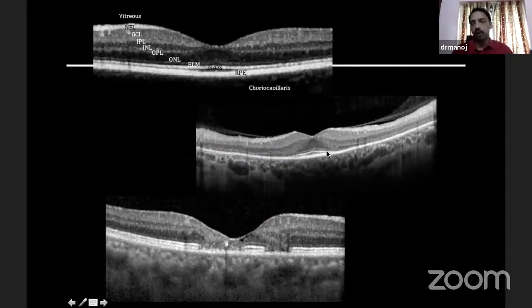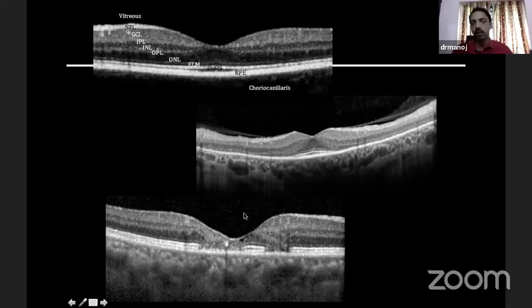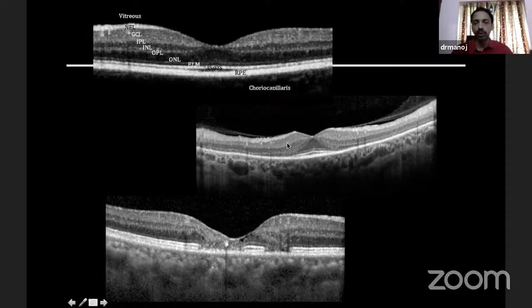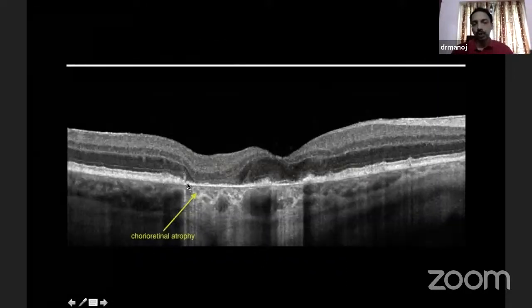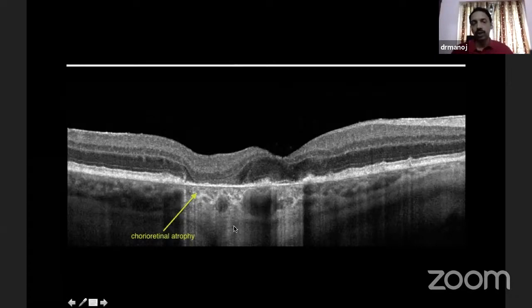Sometimes the outer retina, especially the photoreceptor or ellipsoid zone, may be absent in a patchy manner, or there may be diffuse loss of the layer with just preservation of the central area. This is a typical finding in hereditary dystrophies like retinitis pigmentosa and also in drug toxicity like chloroquine toxicity — you may see the preserved central island of photoreceptors with no ellipsoid zone beyond. This is an example of a patient with geographic atrophy, where the retinal pigment epithelium is totally lost, and therefore light easily passes through and the choroid is visualized.